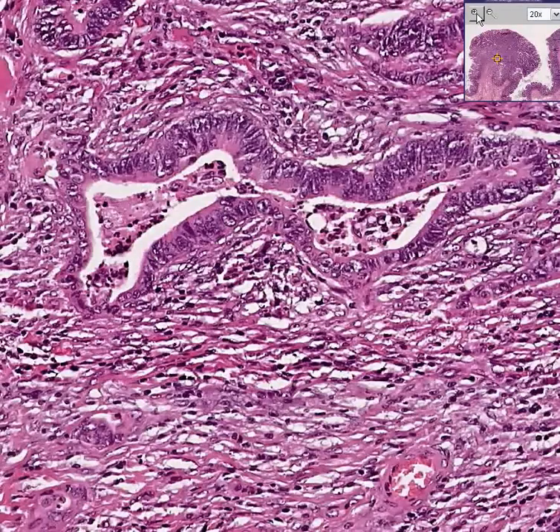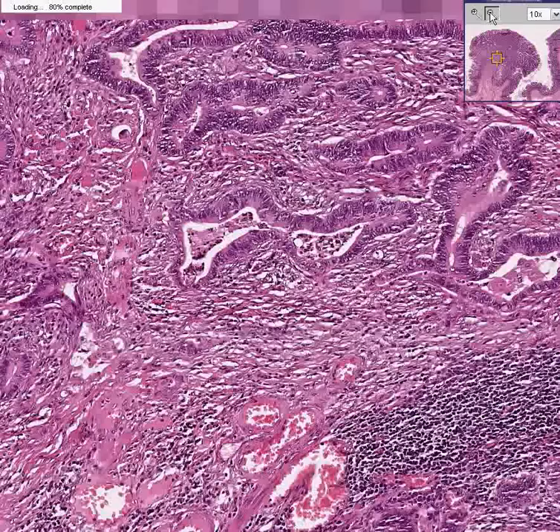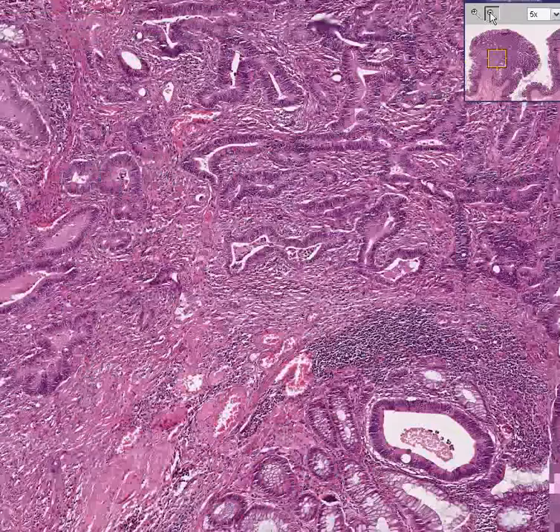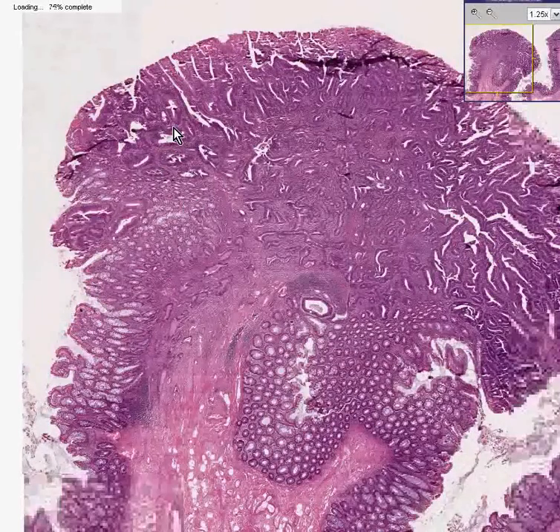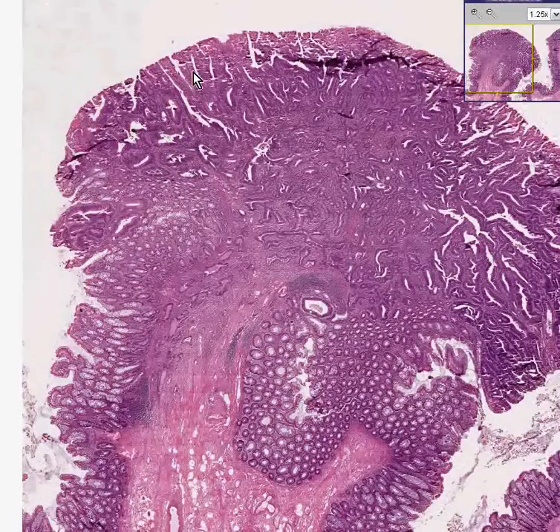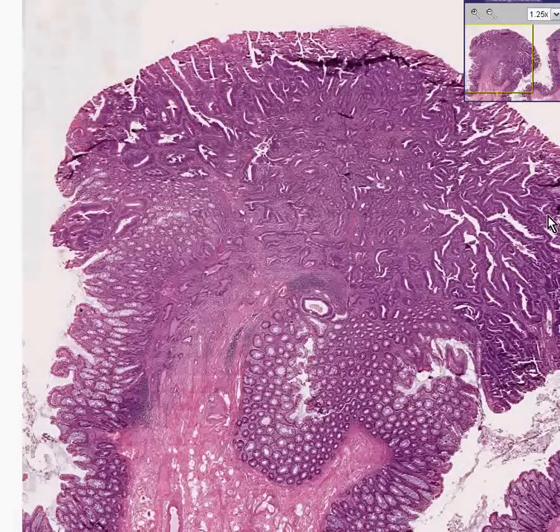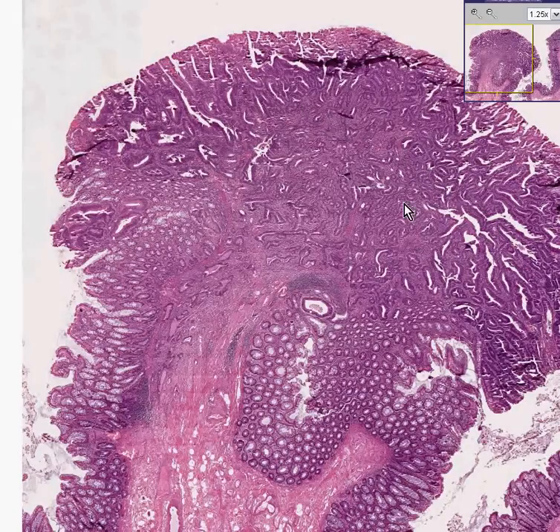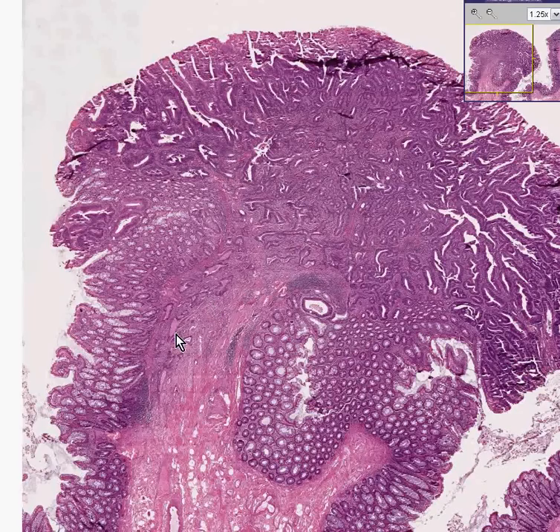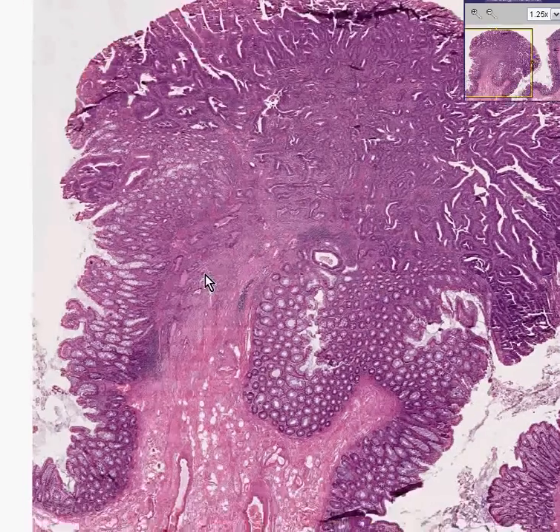Let's get a lower power view of that, just to show you from a bird's eye view that even though you might describe these changes out here as being classically adenomatous polyp or tubular adenoma, somewhere along the line there's been a malignant change and now some of these glands are infiltrating into the stalk.